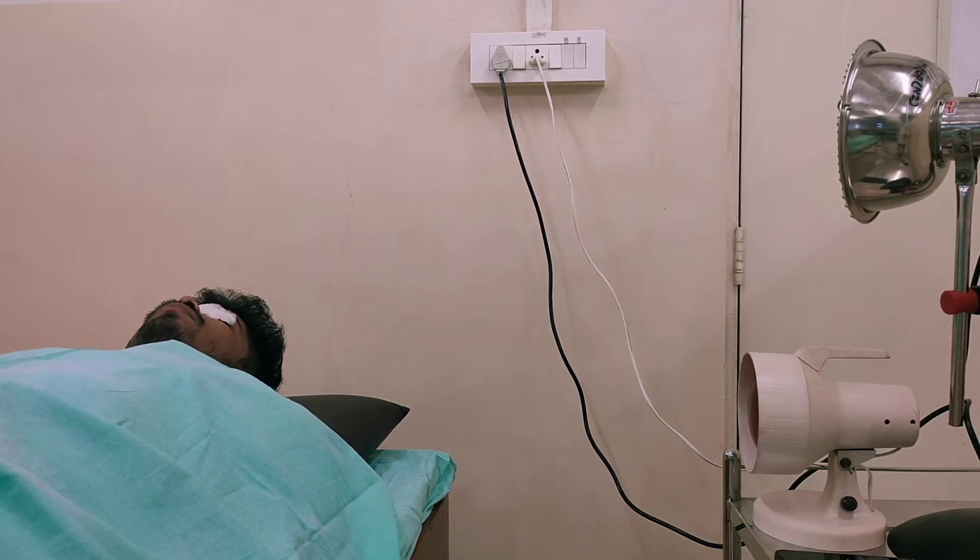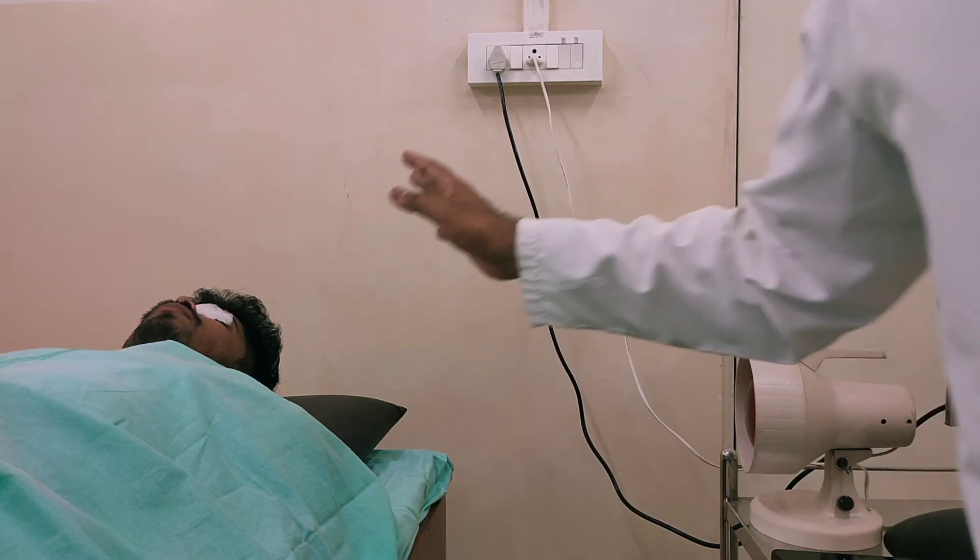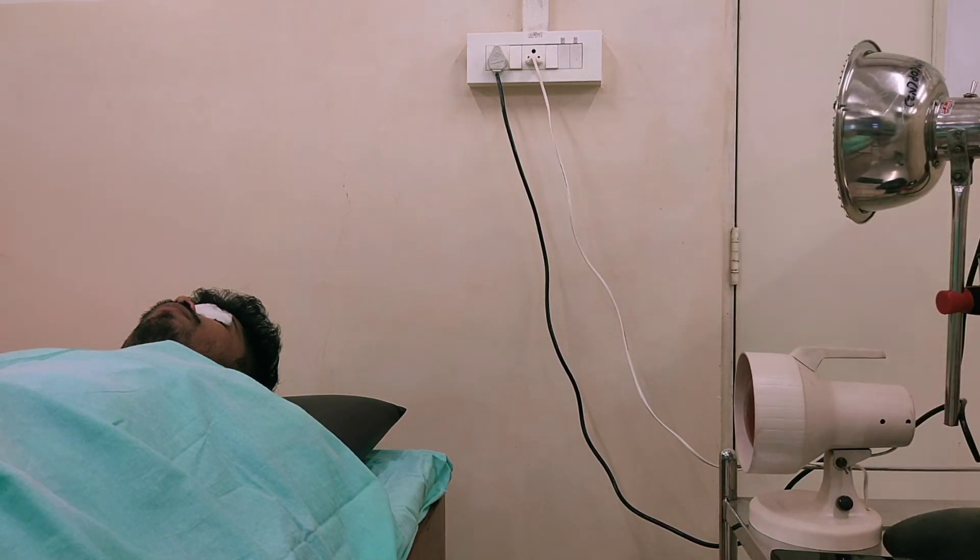Always check for sensory examination of whichever part you are applying. You should have with you a tester whenever you are doing the IR application on the subject. You should carry a tester, a measuring tape, and your sensory kit. Mostly two test tubes should be used — one with hot water and one with cold water — to check the sensations.